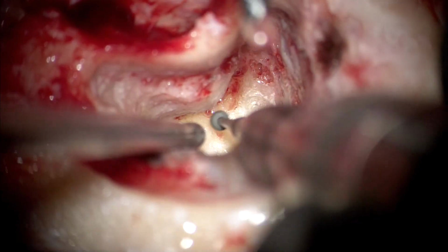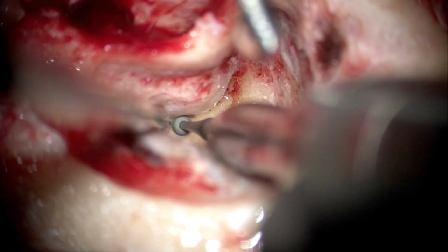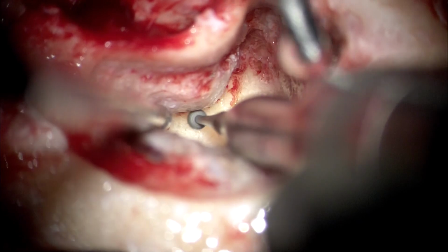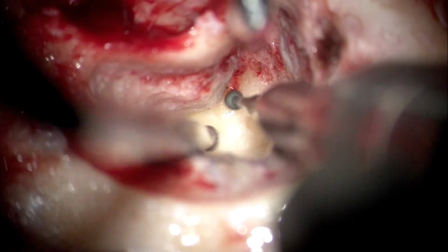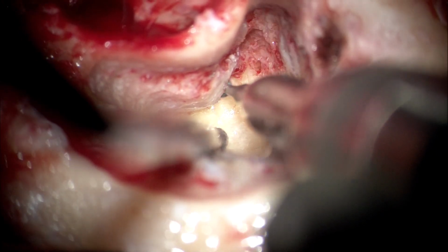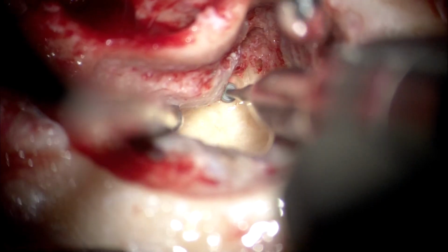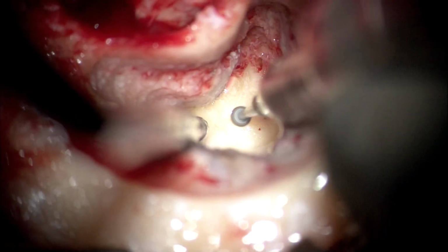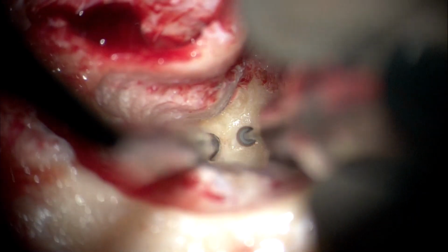We could use a small size diamond here, probably 1.5 or 2 millimeters, to just drill lightly onto the medial wall of the vestibule, taking a lot of care so that the edge of the burr does not traumatize the undersurface of the tympanic genu or the second genu of the facial nerve. This is just done inside the vestibule slightly to be able to totally clear the vestibule of its neuroepithelium.